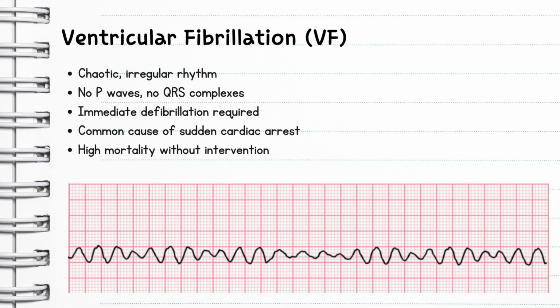Now, if the patient is already hooked up, already has the pads placed on the chest, you've been monitoring them, and all of a sudden you see VFib, you're going to go straight to the shock, okay? That's what we need to do, okay?